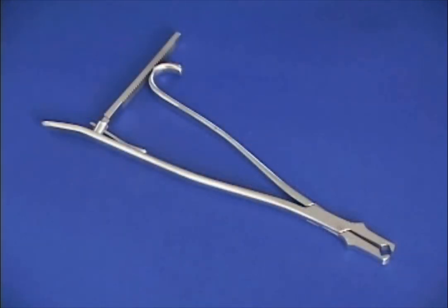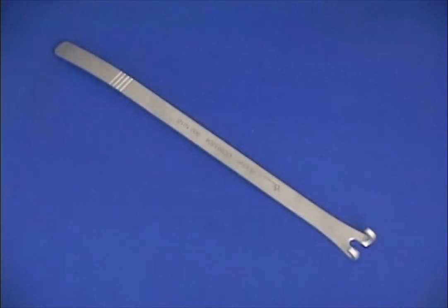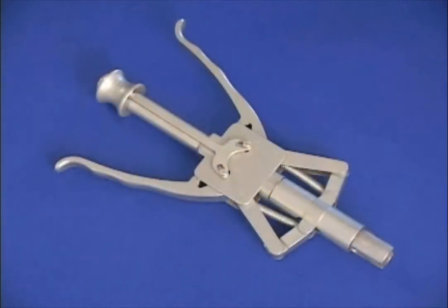The rod holder can be utilized to introduce the rod into the wound, to manipulate the rod, or to accommodate additional compression or distraction. The rod rocker is utilized for minor translation of the rod during cap insertion. The rod persuader is utilized for translation of the rod requiring greater than 2 millimeters of reduction.